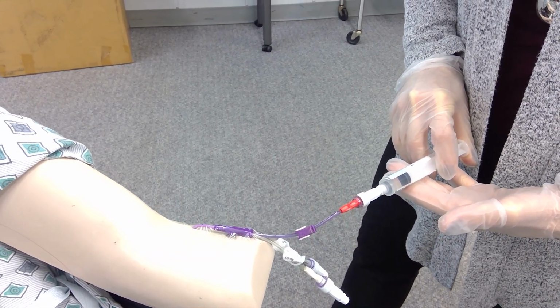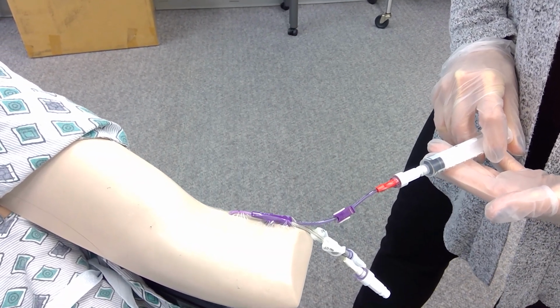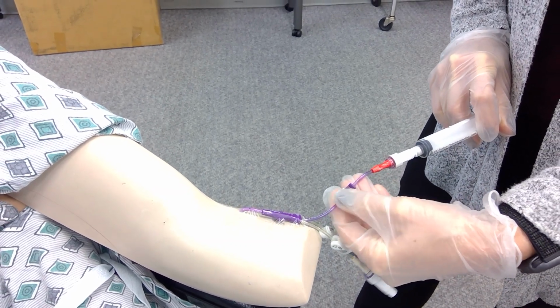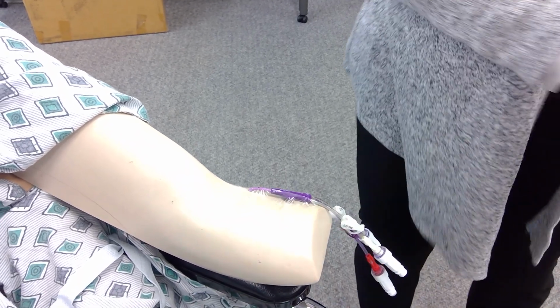Then once I get to the very end, I'm going to end in positive pressure, meaning that once I push that very last ml, while I'm pushing, I clamp the line. Unattach that syringe.